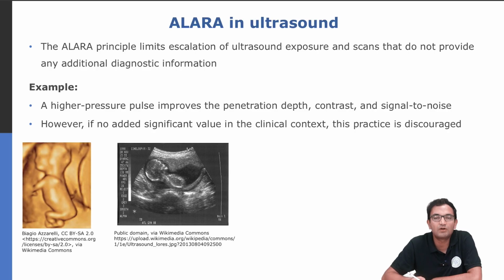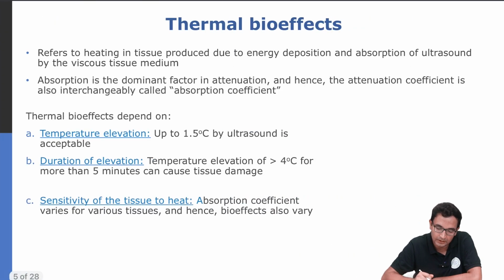Therefore, it's favorable to go with two-dimensional ultrasound because of the ALARA principle. And this is one of the reasons you will still see two-dimensional ultrasound images being very actively used, even though 3D is available. And the other variable, of course, is cost, because 3D systems are more data intensive, more complex and more costly.